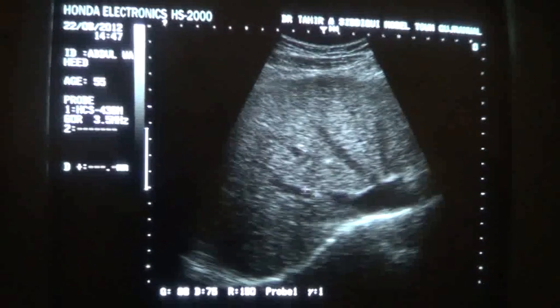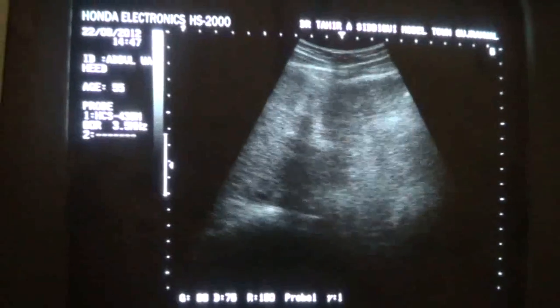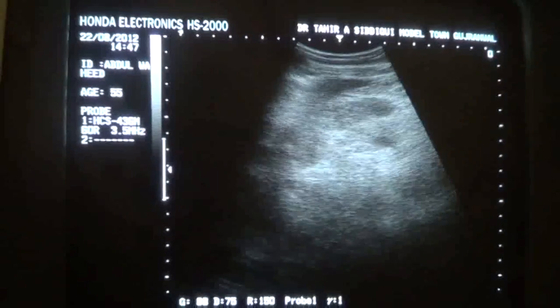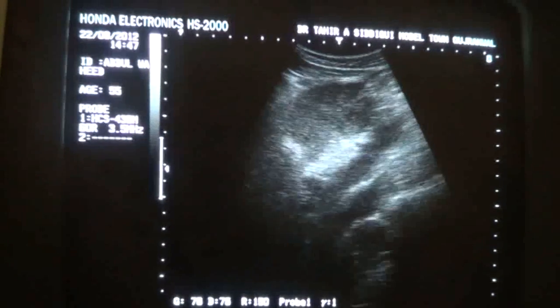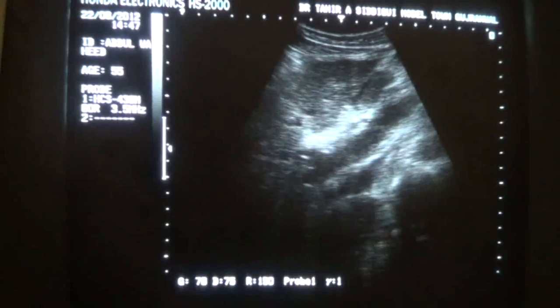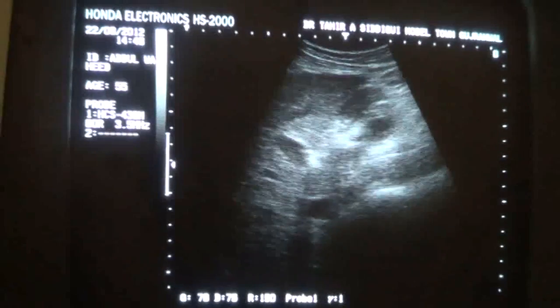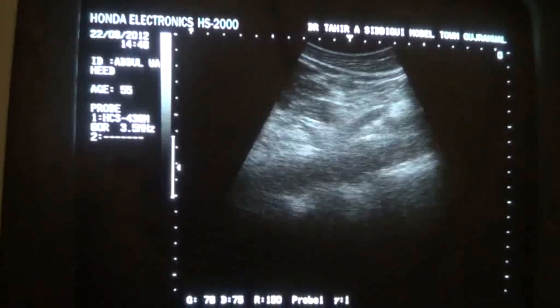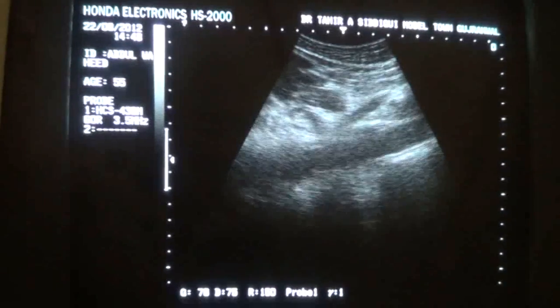This is the right hepatic vein entering the inferior vena cava, the middle hepatic vein, and the left hepatic vein entering the IVC. There is no evidence of adenopathy at the region of the portal hepatis. This is the region of the portal hepatis. And there is no evidence of adenopathy at the para-aortic region as well.